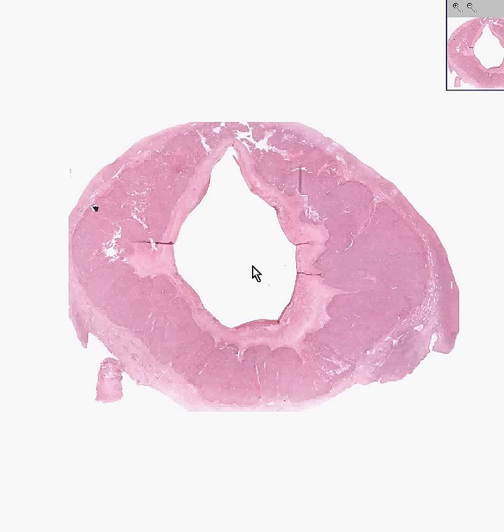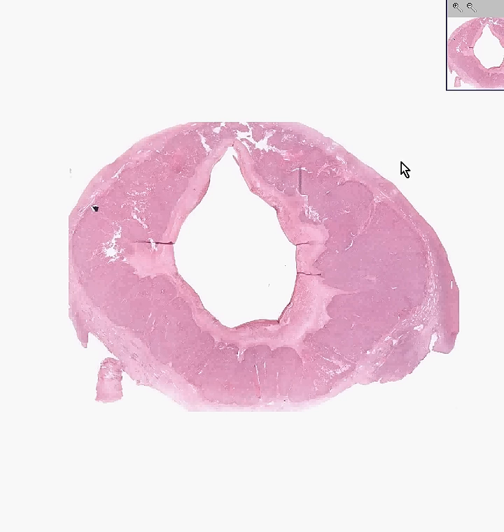In the previous slide of ovary, we described all the various stages of follicular development up until the final pre-ovulatory follicle called the Graafian follicle. The Graafian follicle was loaded with granulosa cells, which secrete estrogen under the influence of FSH and LH from the pituitary.